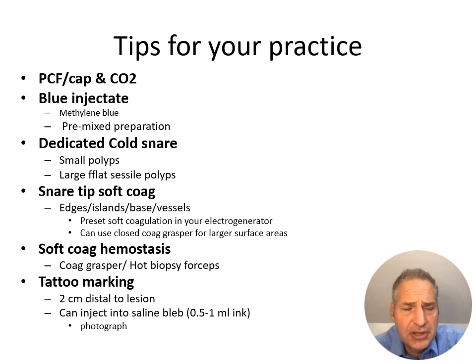Additional techniques that can improve outcomes with EMR include the use of a blue injection submucosal solution, the application of dedicated cold snares, the performance of snare tip soft coagulation for the margins and base of the polyp, soft coagulation hemostasis with a coag grasper, and performance of tattoo marking distal to lesions that require additional inspection or may require surgery in the future.